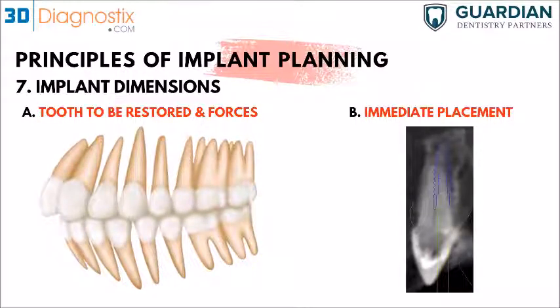But if you're going to be placing an implant in a site where the bone is virgin, then it does not matter to use a 13 or 15 millimeter implant, because that's not going to help with osseointegration. It only helps with the primary stability of the implant. So usually I wouldn't recommend placing a long implant in native bone or virgin bone.